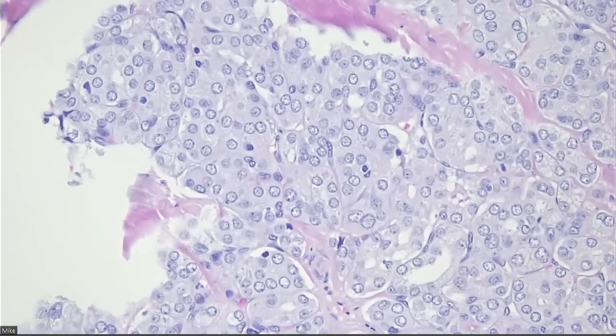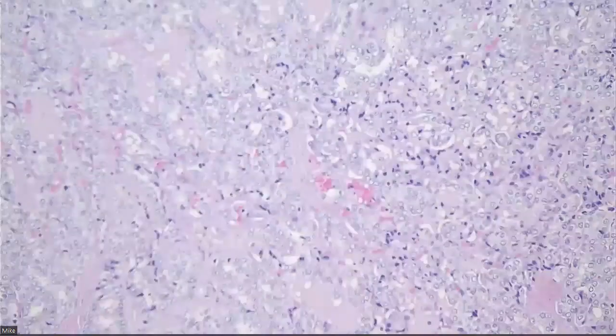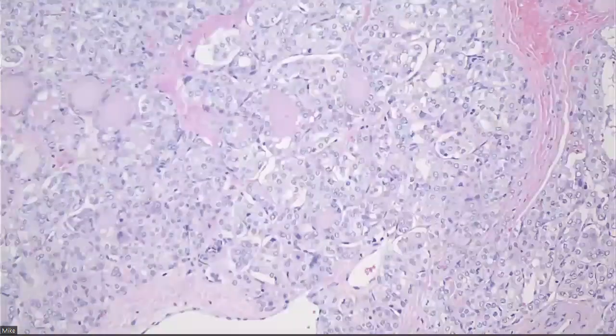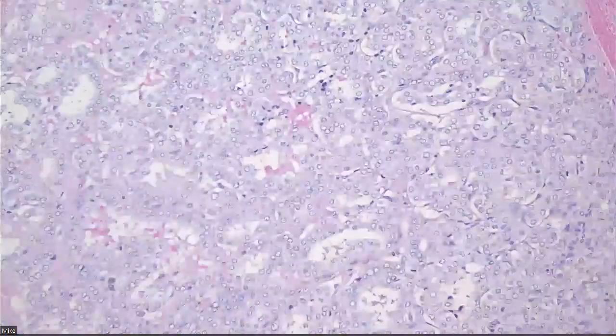All right, now let's look at the nuclei. Some areas, arguably, these are really round, right? Like these are really round to me, but cleared. And then in other areas, they get even more clear, right? We don't want to focus in on just one area. We want to look all around because, as we said, the severity, the intensity, and the diffuseness of the nuclear changes might suggest one way or another whether we're dealing with a true PTC or not.